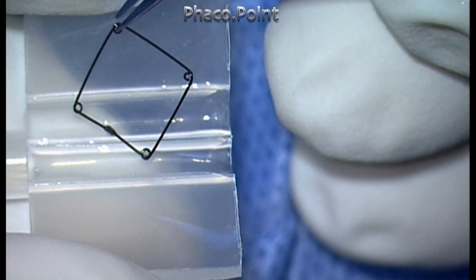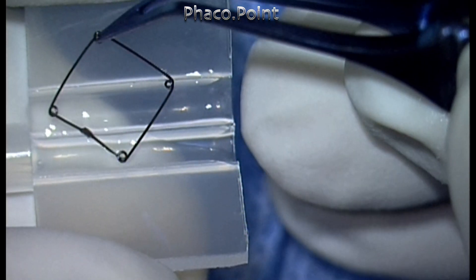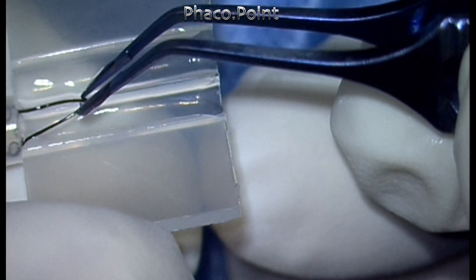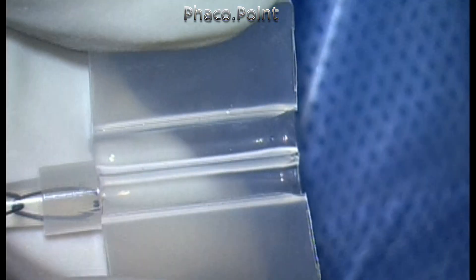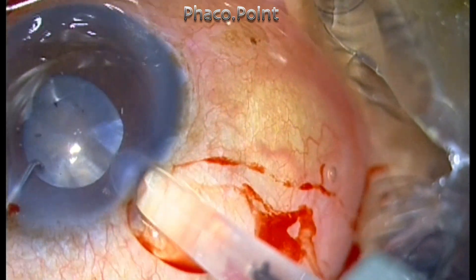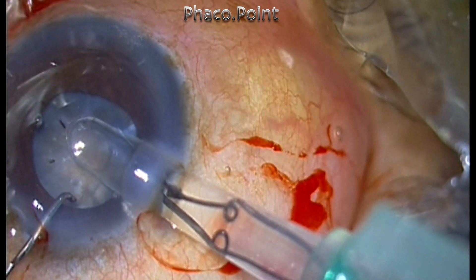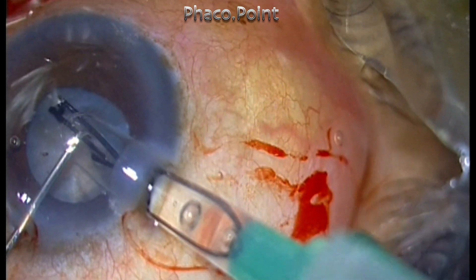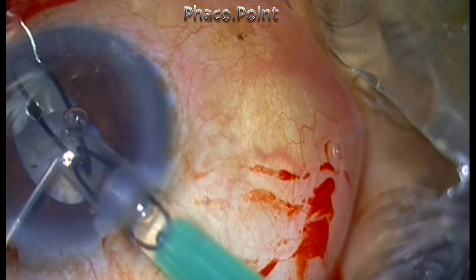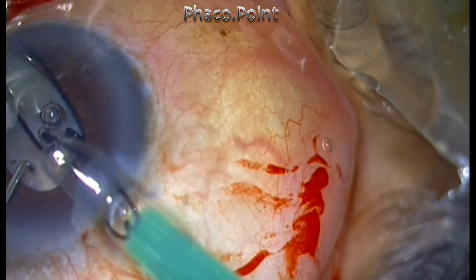The ring is loaded onto the injector system and then injected into the eye. The chamber is extremely shallow, so you have to be very careful while injecting the ring. I'm able to engage three of the four loops onto the pupillary edge while performing this injection.